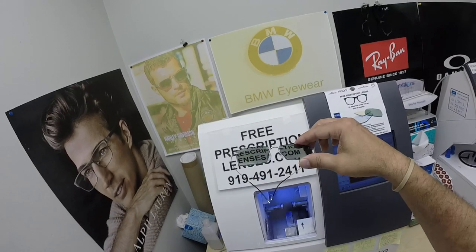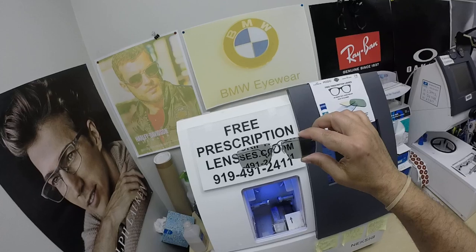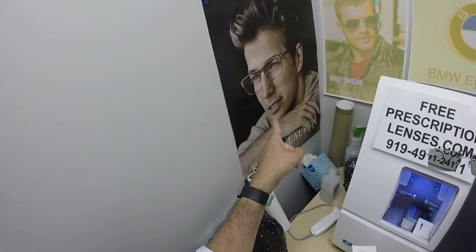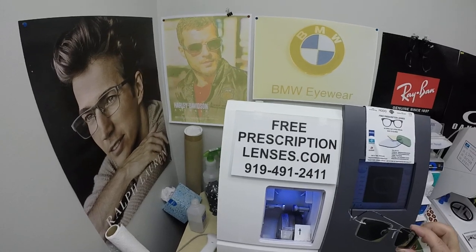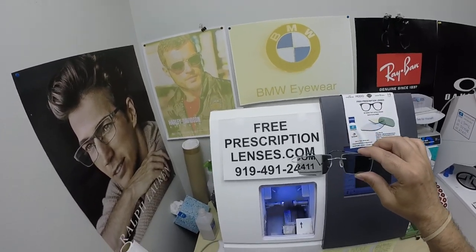You've still got the green lenses with the green hue on them — Mr. Green. I can find you some green polos; I know Polo does a really good colors collection. If anyone has any questions, go to the Contact Us page of the website. You can email us directly at freeprescriptionlenses@gmail.com.